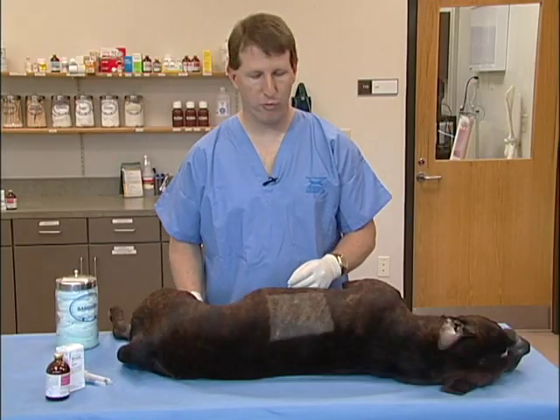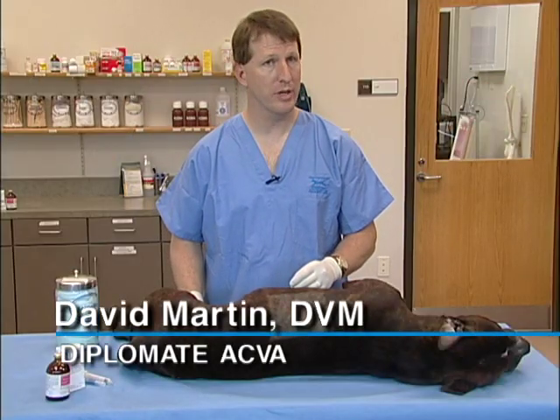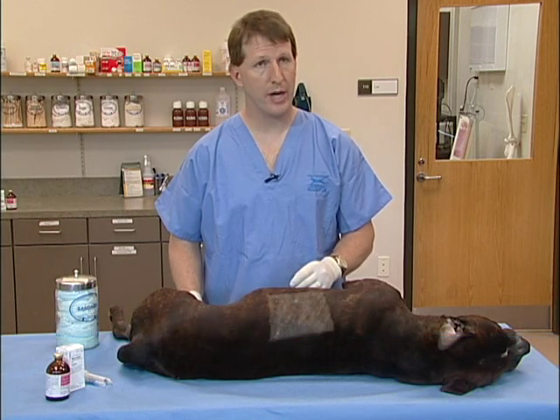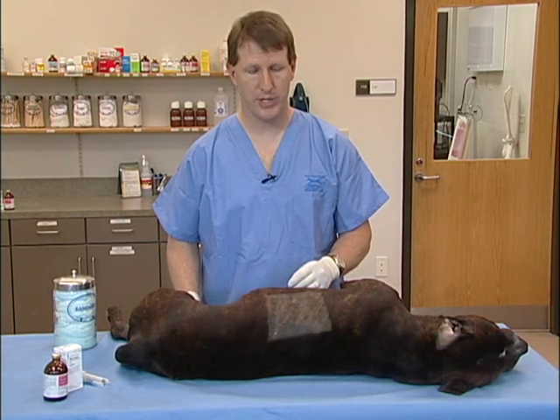The intercostal nerve block can be performed for blocking out a rib after rib fracture from an animal that's been hit by a car, for a thoracotomy, or for placement of a chest tube.